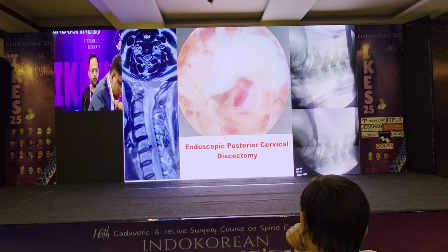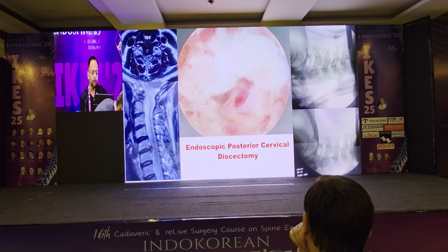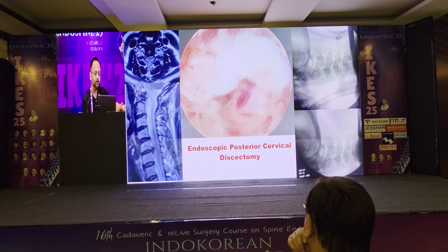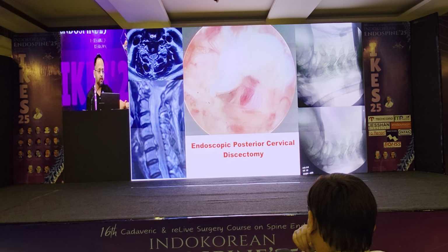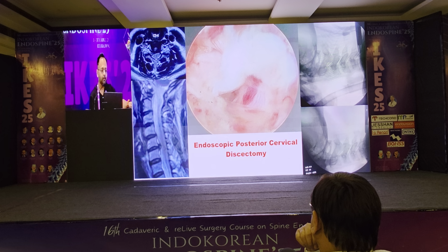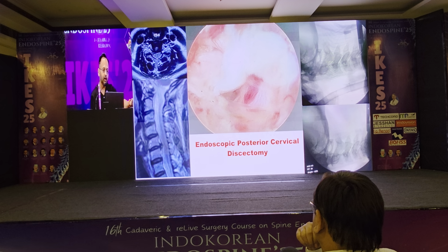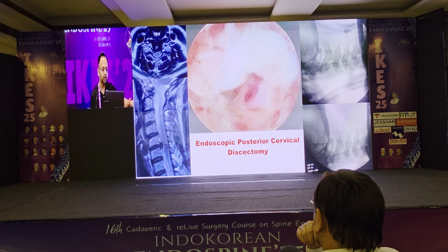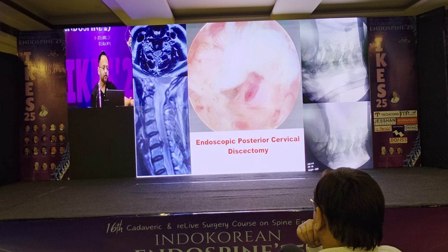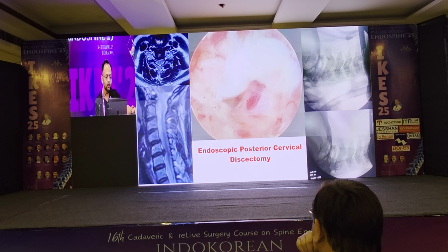My perception of cervical spine surgery has been completely changed after endoscopic spine surgery. We have a talk tomorrow by Dr. Lim. Initially my selection of cases was only laminoforaminotomies and only lateral discs. Now even for CSM, cervical spondylotic myelopathy, we are trying to do decompressions and achieving similar goals.